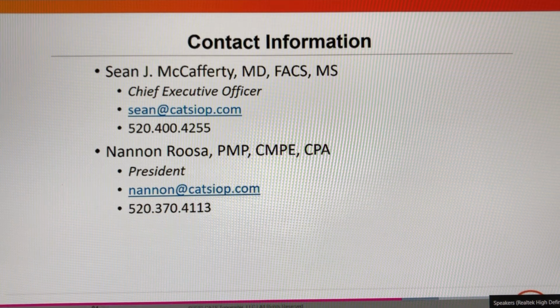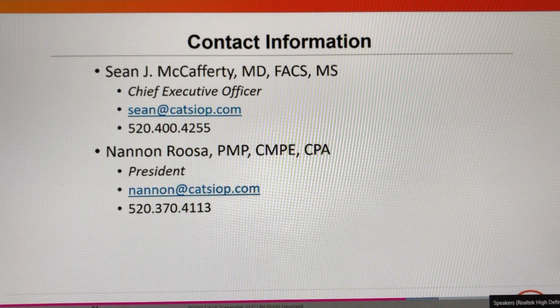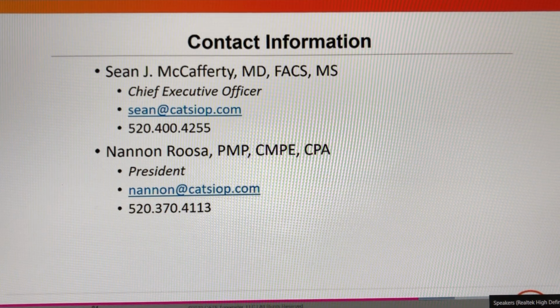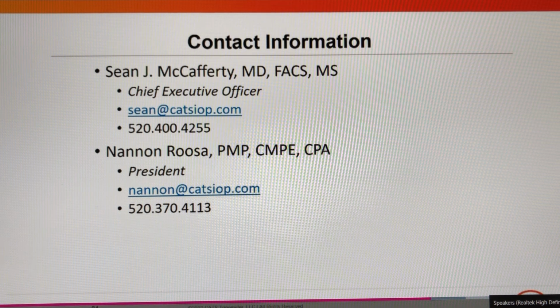Got it. Thanks. So a couple thoughts. First of all, you said it's better than Goldman applanation tonometry. How much better? Well, if you look at a standard population curve, about 30% of the people or more, actually upwards of 50%, fall outside plus or minus 2 millimeters of mercury. Several studies say that plus or minus 2 millimeters of mercury could change the clinician's decision-making process. So if we use that as a limit, and you decrease the sensitivity to CCT, corneal rigidity, and corneal tear film simultaneously, about 97% of the patients will be within plus or minus 2 millimeters of mercury, as opposed to upwards of 50% being outside of that limit. So that's really where the better comes in.